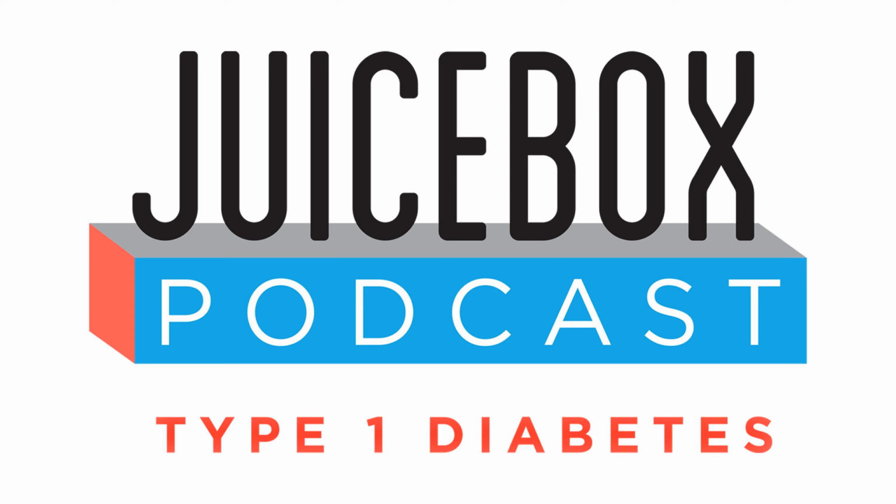Yeah, I think for a lot of endos, they use the insulin action time of 3 hours to give people permission to bolus when they're high. Like, hey, if it's close to 0, go ahead and correct, because after 3 hours, insulin's mostly done. Rather than tell people, hey, this is how long insulin lasts, and if you see this number, round down. The better idea would be to use a better tool, but those are limited, right? You can use Nightscout, which has a better insulin action calculator, xDrip, Spike, these other open source apps, and Loop. The insulin models they use for how insulin hits and decays are much more accurate than what comes standard in most pumps. So it's just a matter of getting these tools.